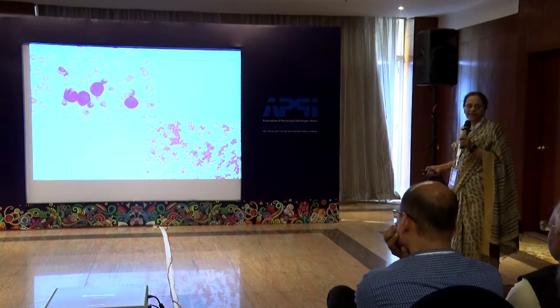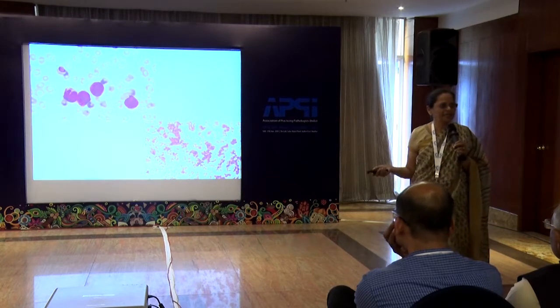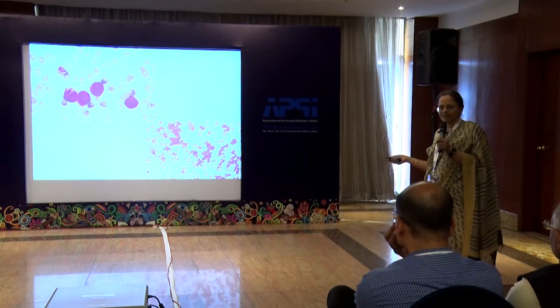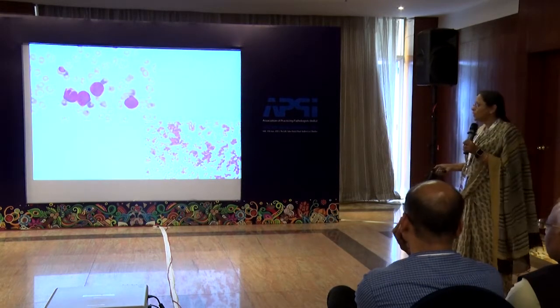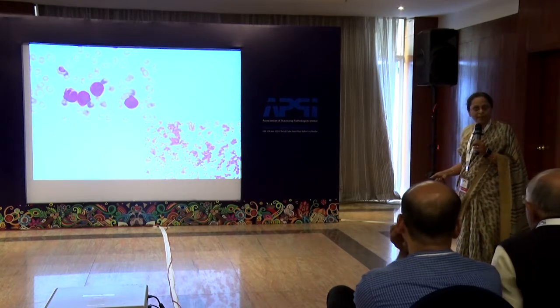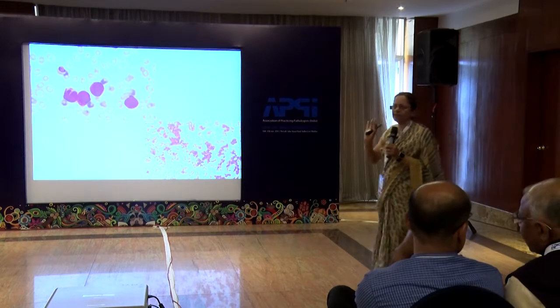Classical cells. I just kept some to remind us, like we had a UG biochemistry class, we can go back to some nice UG pathology class. This is a classical cell. It has a name too, Faggot cells. So leukocytosis with these kinds of cells is diagnostic for APML, a diagnosis that should never ever be missed.